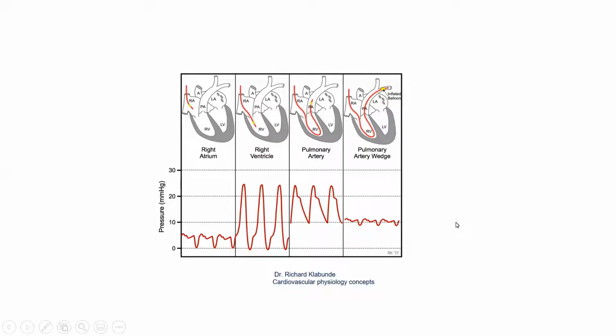You have to familiarize yourself with the way the hemodynamic tracings look like. The most important part of the Swan-Ganz is that while you are pushing it through, sometimes you can find difficulties, especially if you have TR and PR, okay? And the hardest part of all this is which part? Yani, to position it in the right atrium, RV, pulmonary artery, or which? Which is the one most prone to error in the positioning?